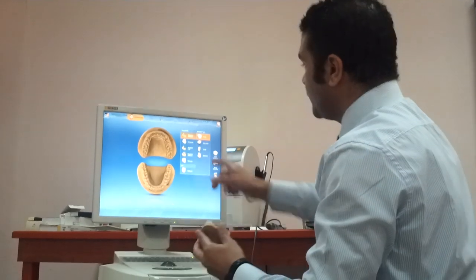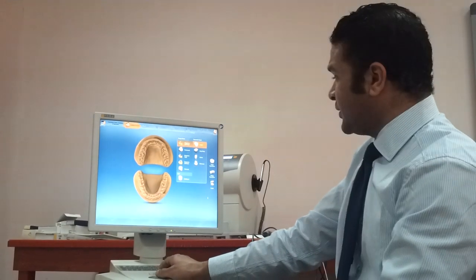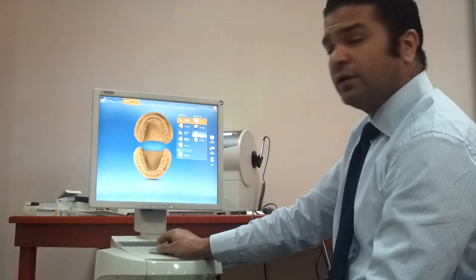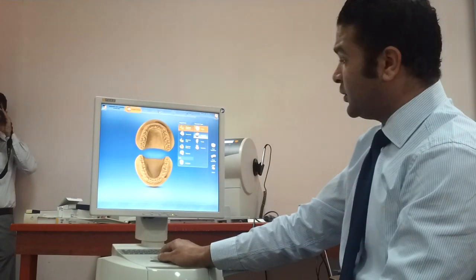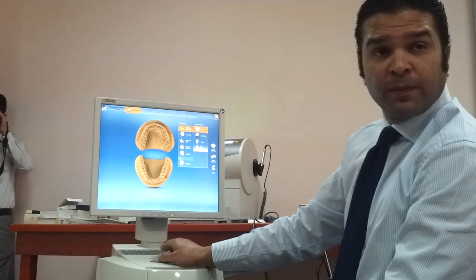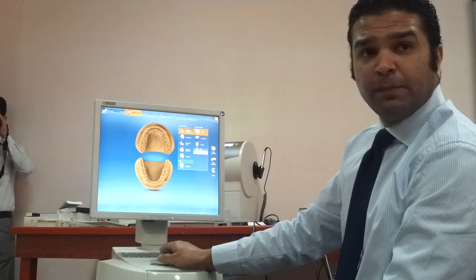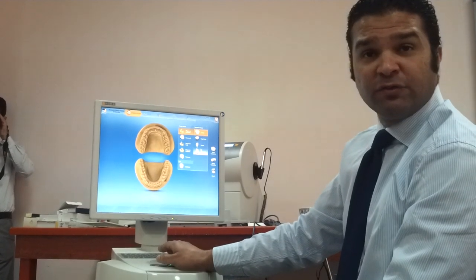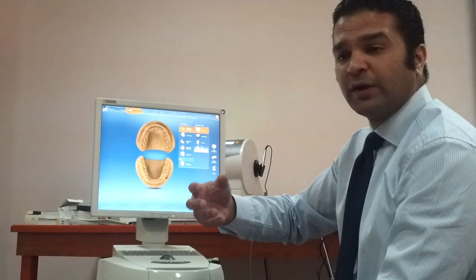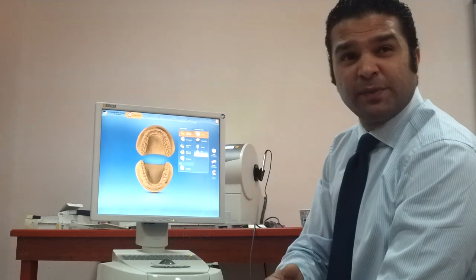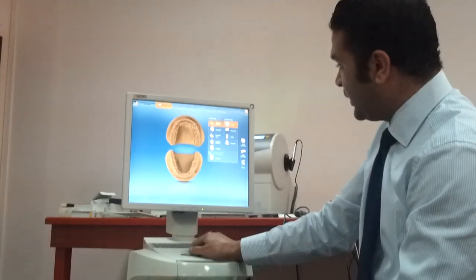The software will ask me what I would like to do — whether a single restoration — and it gives me four indications: a crown, an inlay, an onlay, or an abutment. For those doing implants, this system can help you construct an all-ceramic abutment for an all-ceramic restoration, avoiding the risk of metal display from a conventional metal abutment. I will choose a crown here.